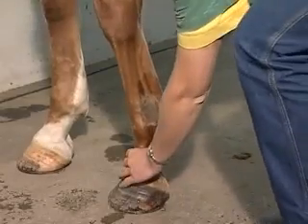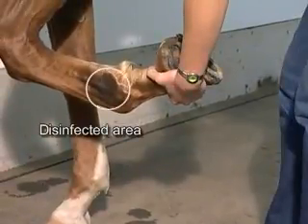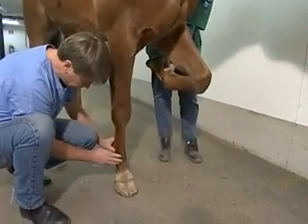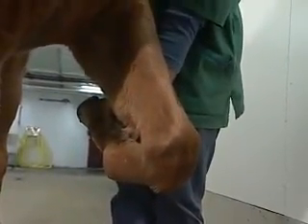If the injection is to be performed with the leg in the flex position, the assistant who holds the leg must be careful never to touch the clipped sterile area. If the injection is to be administered with the horse putting weight on the leg, the assistant lifts one of the forelegs to prevent the horse from lifting the leg that is to be injected.